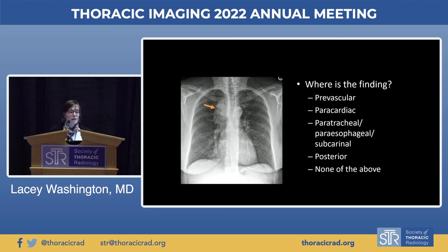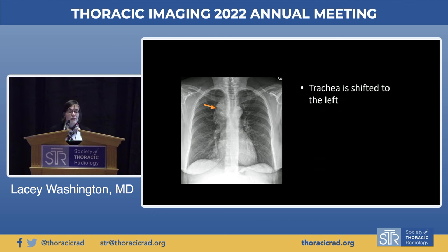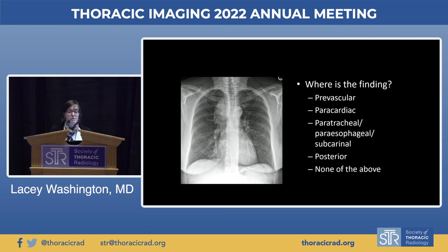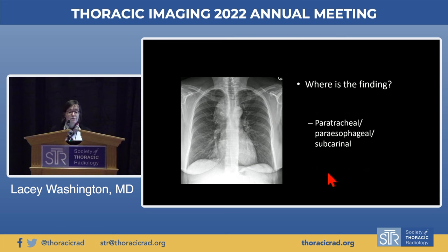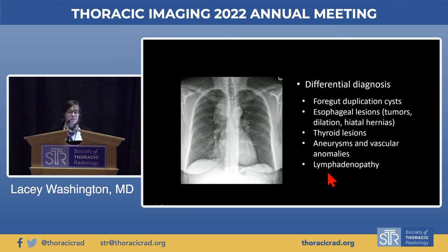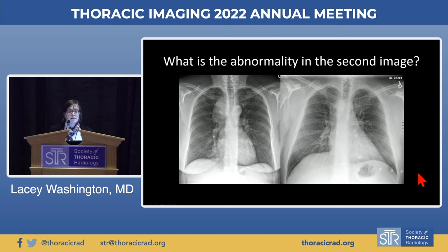One more case: the trachea has shifted to the left, placing this finding in the middle mediastinal — paratracheal, paraesophageal, and subcarinal — differential diagnosis. On this case, you have a long differential diagnosis and there's not much we can do beyond that on the plain film alone.